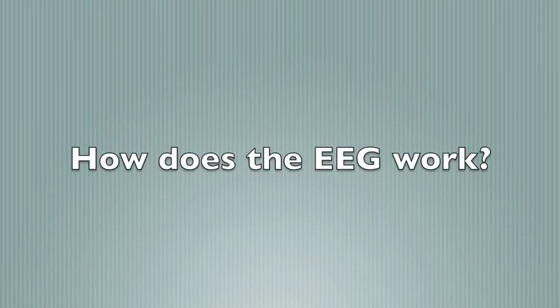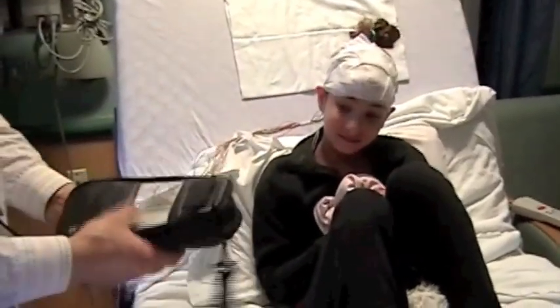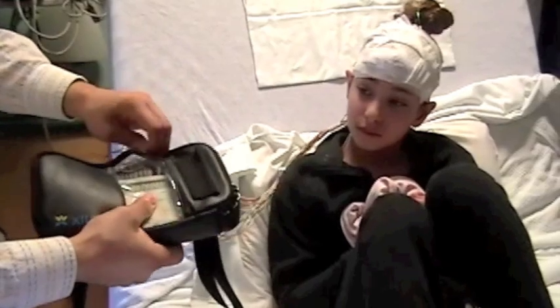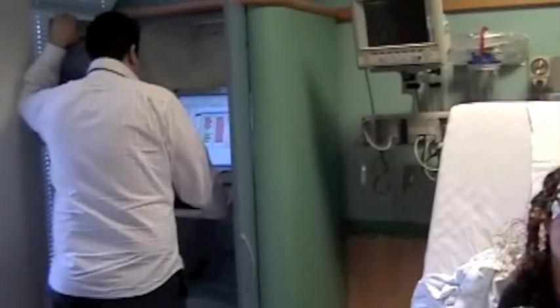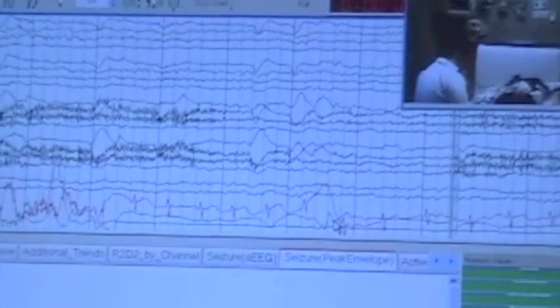You might be wondering how the EEG works — Erin was too. The wires are connected to a special box, and you'll see the EEG technician put it in a bag and place it next to you on your bed. Those wires are connected to a special computer that you see the EEG technician using. You'll get to see your brain waves — those are Erin's. Can you see Erin in that small screen?